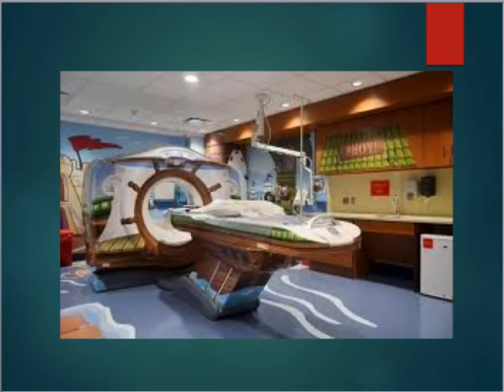This is a CT scanner at a children's hospital. They've just have the whole room painted to look like a pirate ship. I thought it was pretty cool. You know, it kind of helps the kids alleviate a little bit of that fear that they may have. So that's a scary time for patients of that age, you know. I mean, most patients can get nervous, but especially children, it can really make them nervous. So anything we can do to help ease their fears is good.